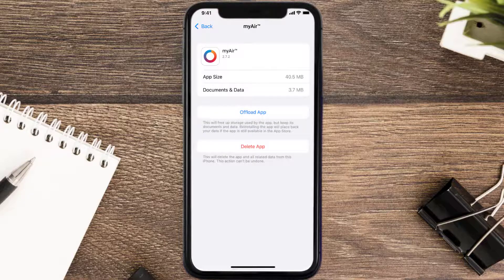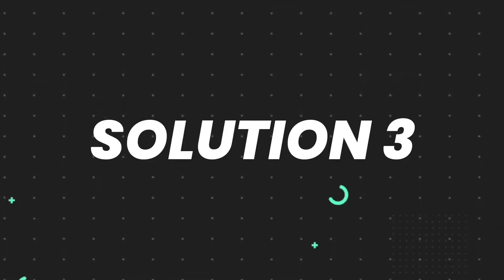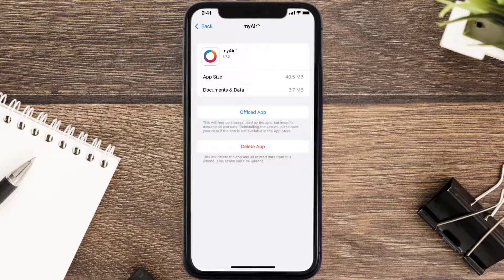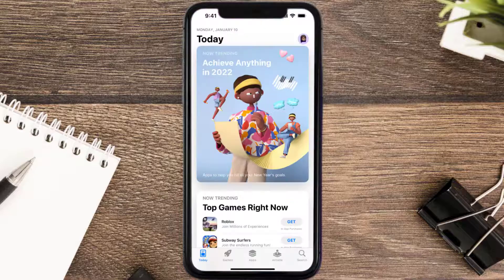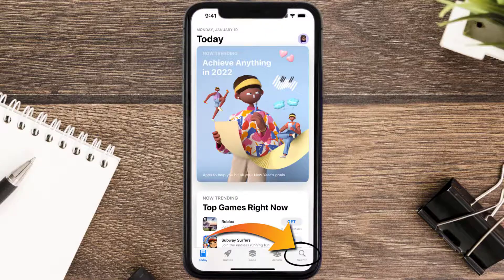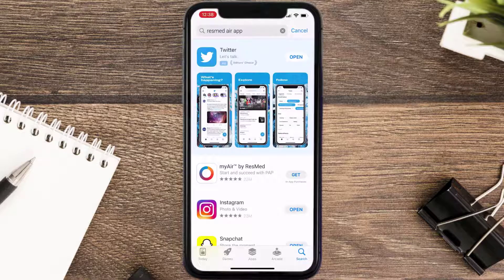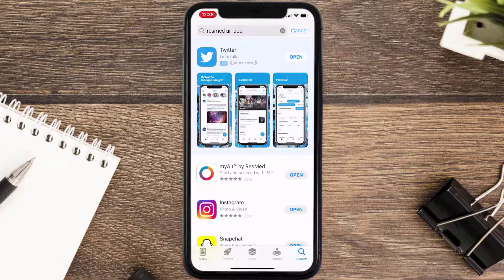If it doesn't fix the issue, you need to completely reinstall the app. Follow the on-screen instructions to navigate all the way to the app page, then tap on Delete App to uninstall it from your device. Once uninstalled, open up the App Store, search for the app, and tap on the Get button to install it back on your device. Hopefully this will fix the issue.